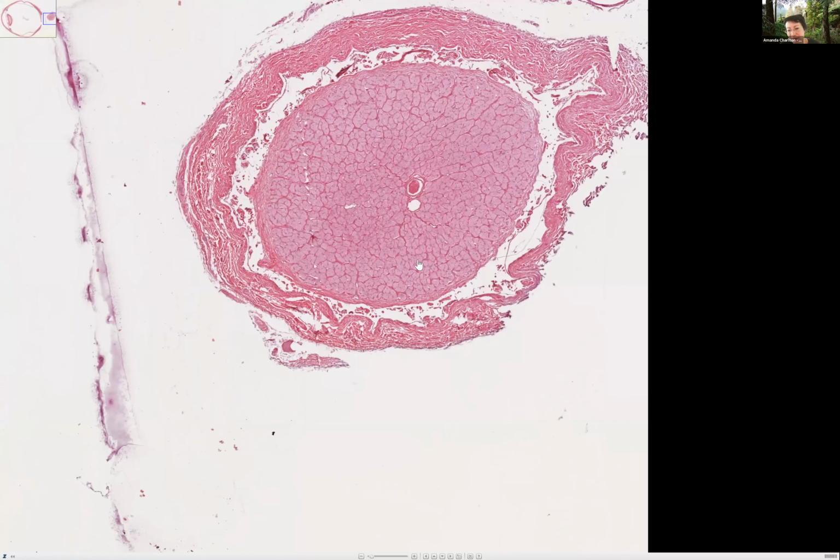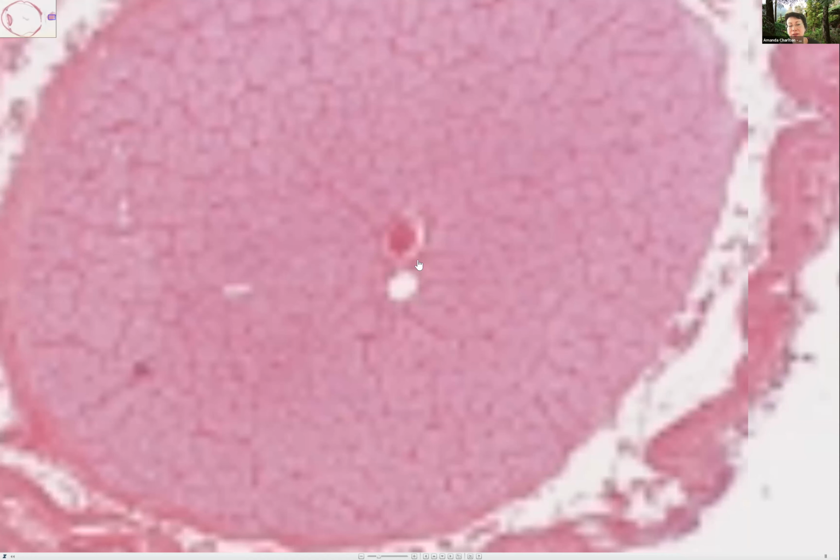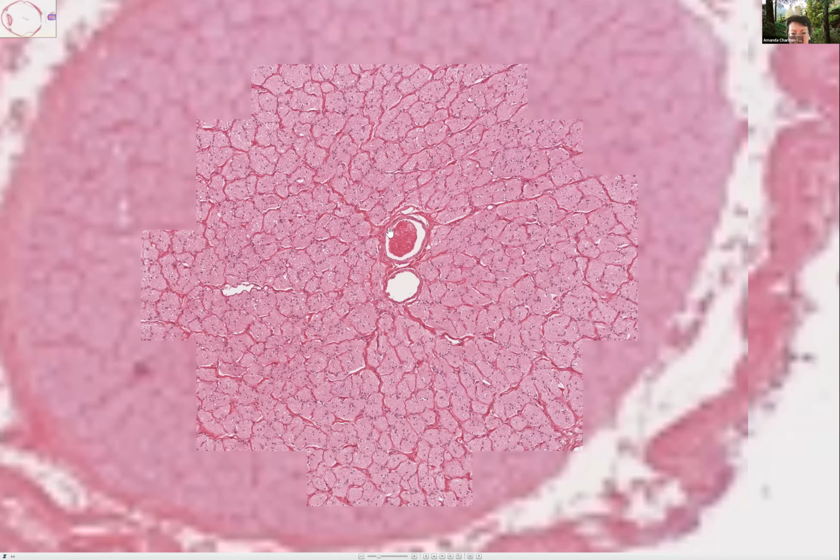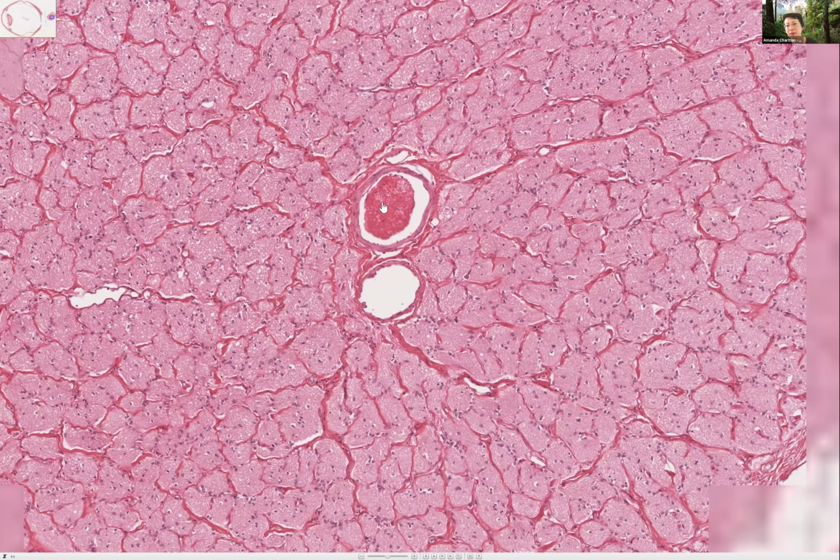And as we zoom up and have a look, I want to see if there is a thrombus or an embolus or even a vasculitis causing a subsequent ischemia to the retina. And here I'm having a look. I don't know if this is possibly a thrombus, I'm not sure. So I see red cells and I see a bit of a fibrin web joining them together. It's not rendering at the moment, it's coming.